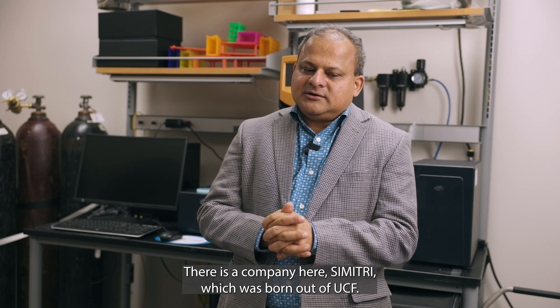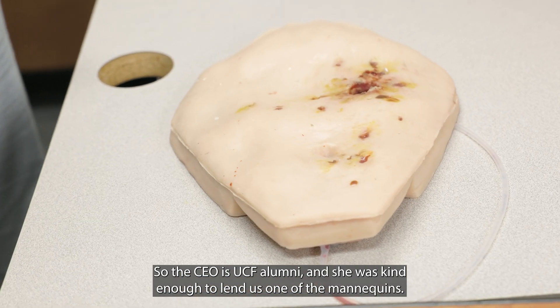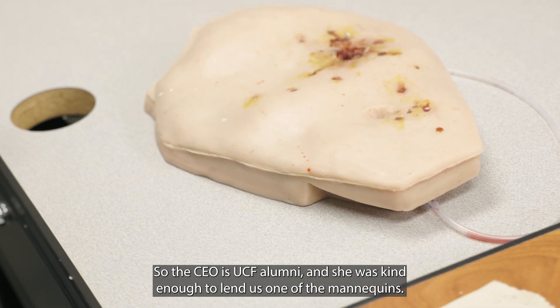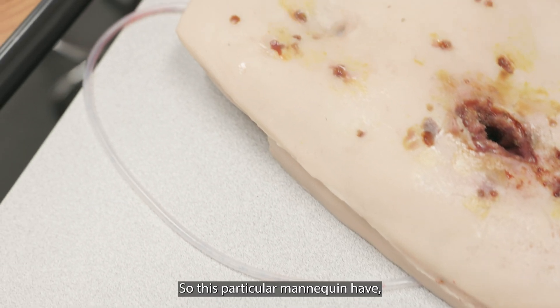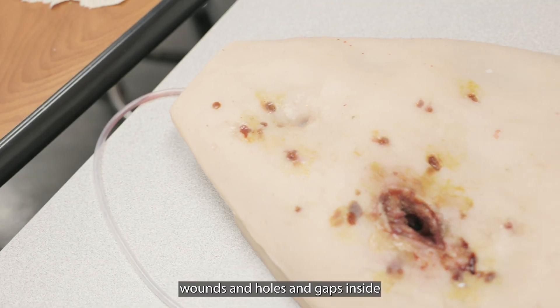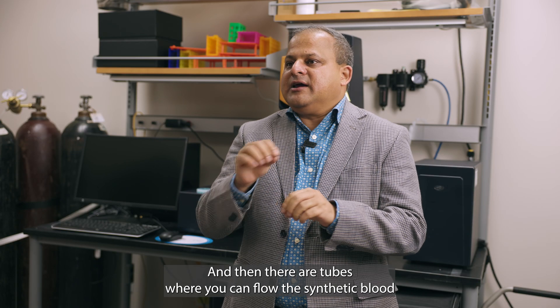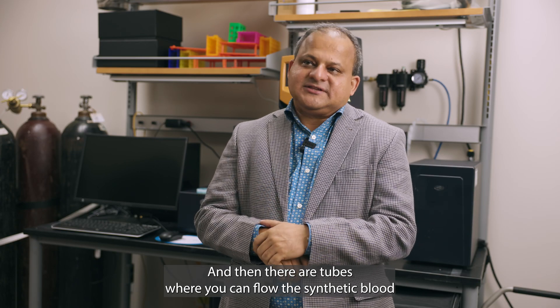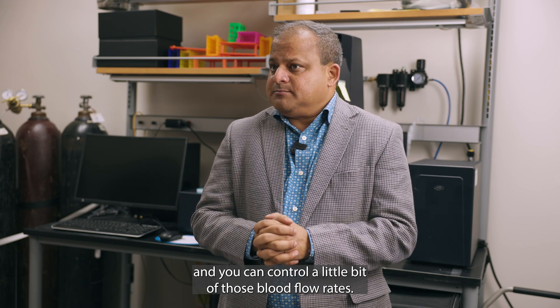There is a company here called SIMITRI, which was born out of UCF. The CEO is a UCF alumni and she was kind enough to lend us one of the mannequins. These particular mannequins have wound holes or gaps inside, and there are tubes where you can flow synthetic blood and control the blood flow rate.